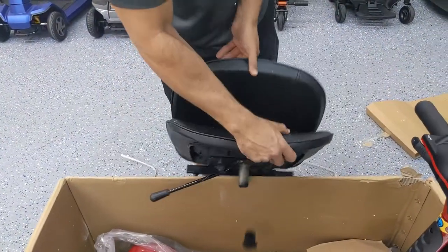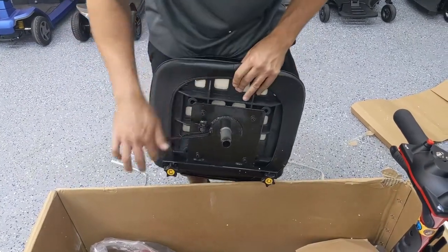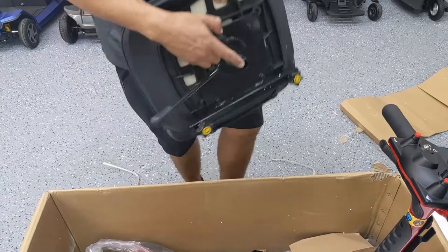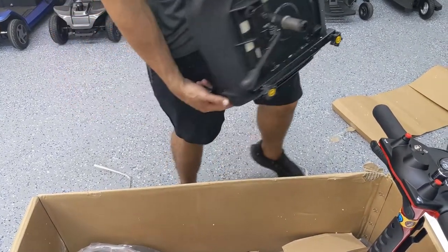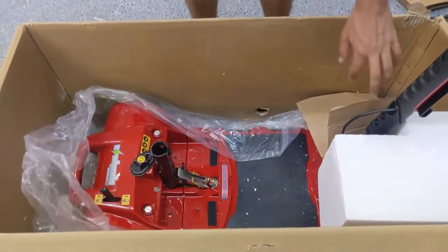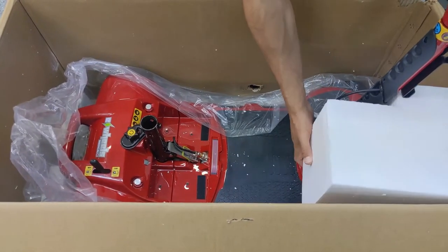It's a folding seat with the option to rotate, it looks like. This was on the male end of the seat post connector — just take it off, it's to protect it. Put that to the side. At this point the scooter is pretty much fully exposed.